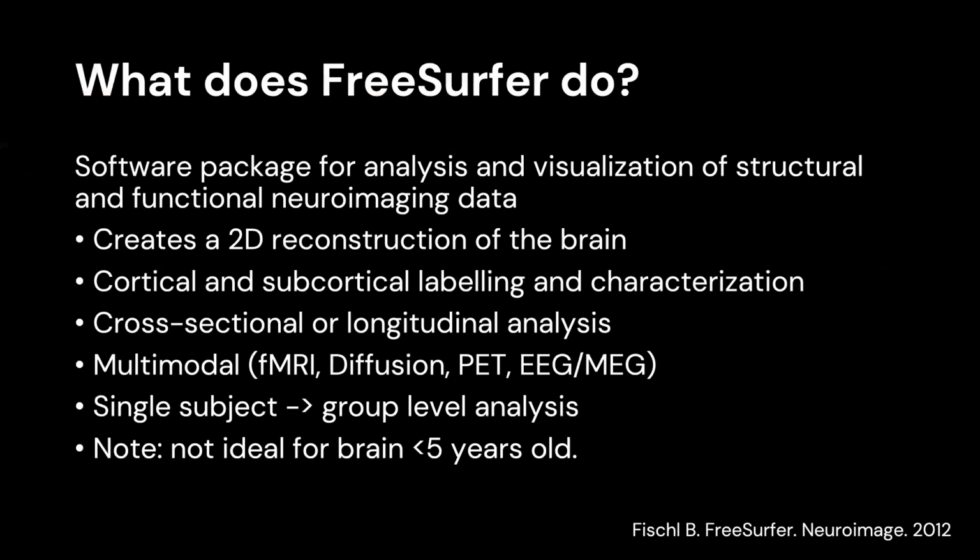So what is FreeSurfer? FreeSurfer is a software package that was created for the analysis and visualization of structural and functional neuroimaging data. It creates a 2D reconstruction of the brain, and this is different to other software that creates a 3D reconstruction. It labels cortical and subcortical regions and it characterizes them in terms of volume, thickness, area, and curvature. It has pipelines for cross-sectional and longitudinal analysis. It provides commands to use multimodal neuroimaging, such as fMRI, diffusion, PET, EEG-MEG.